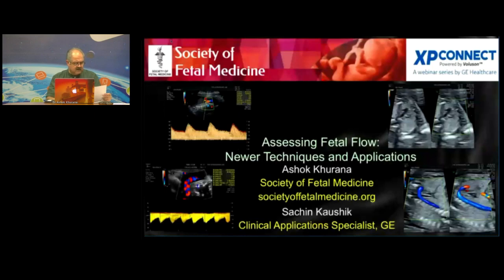Then there is, has elastography any role in fetal assessment of movements? I'm not familiar with that. We could work on that sometime in the future. Fetal flow RI normative: I'm afraid I don't use RI anymore. We only use the pulsatility index. If I'm only going to be using PIs, I have no idea where I've left the RI normatives. I just don't use them. I don't even think about them anymore. Therefore, we will just shift to PIs because the world has shifted to PIs. And we truly must share all of this with the world that, yes, I will do PIs because you are doing PIs. And then we will open our talk again.